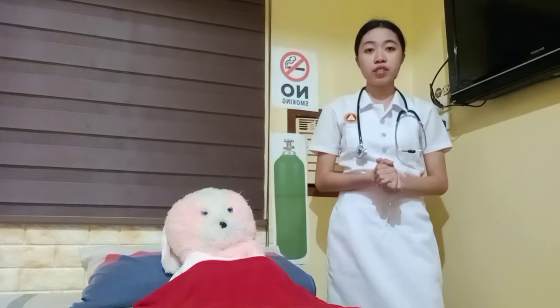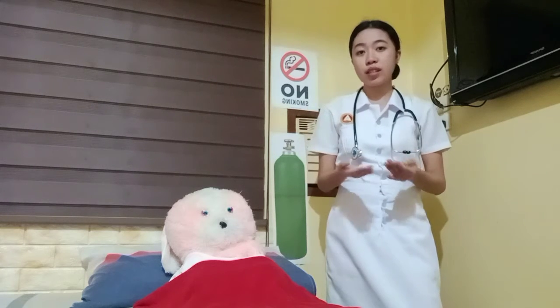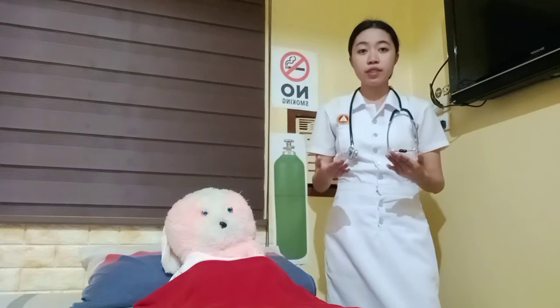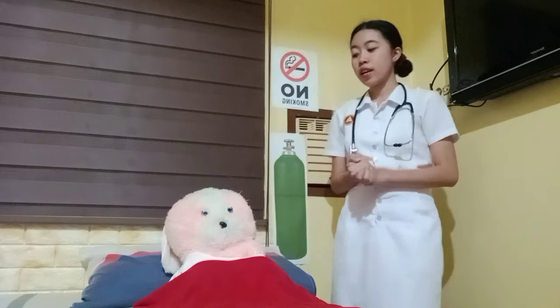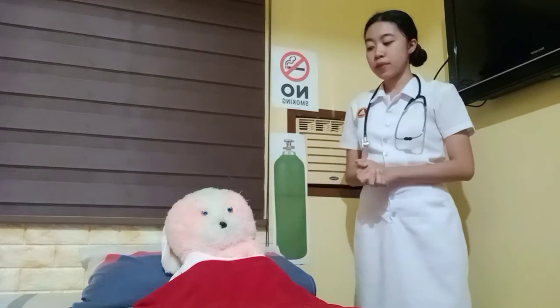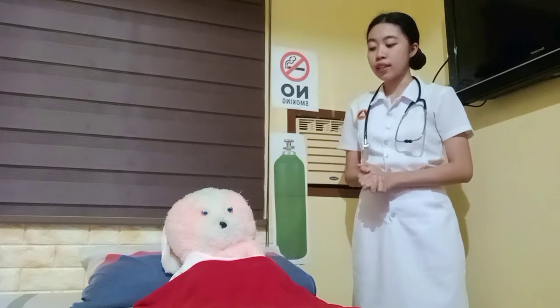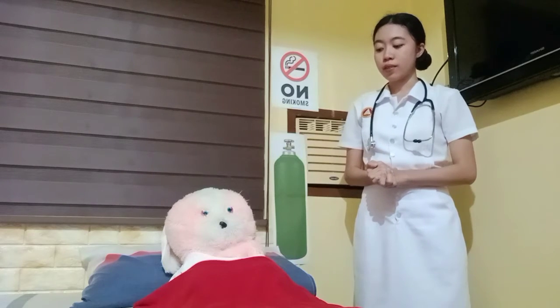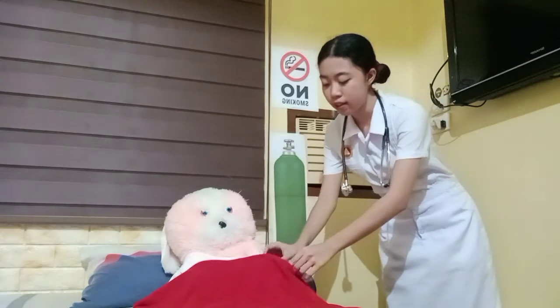So after performing hand washing, identify the client and proceed with the 5 rights of medication administration. So we have right patient, right drug, right dose, right route, and right time. So, good evening ma'am, I'm Trix Legaspi and I'm your student nurse for tonight. Can you state your name and date of birth? Okay, so may I see your wristband?